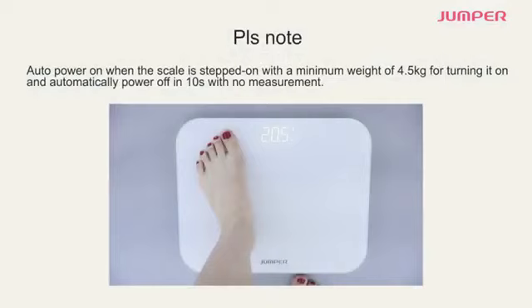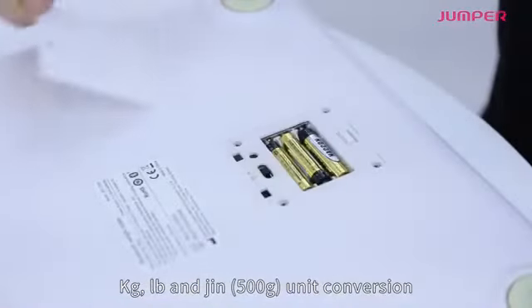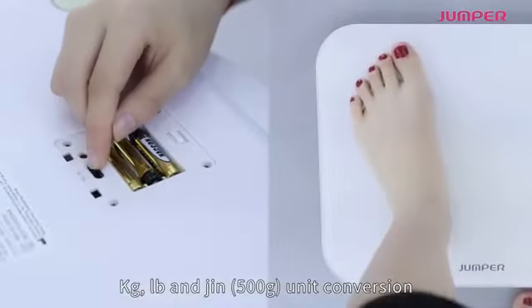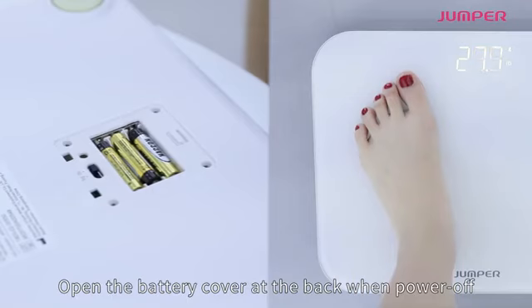Please note: auto power on when the scale is stepped on with a minimum weight of 4.5 kilograms, and automatically powers off in 10 seconds with no measurement. Units available: kg, LB, and jin, (500 grams).